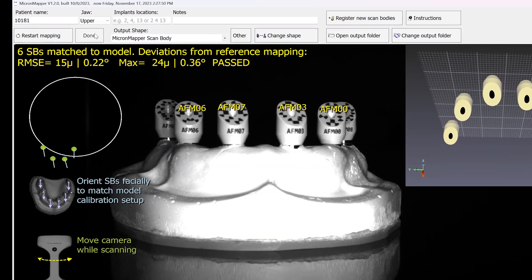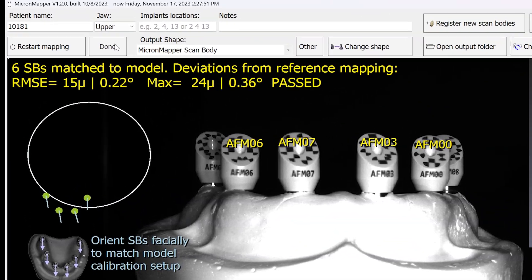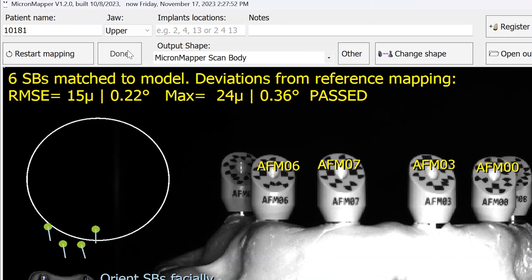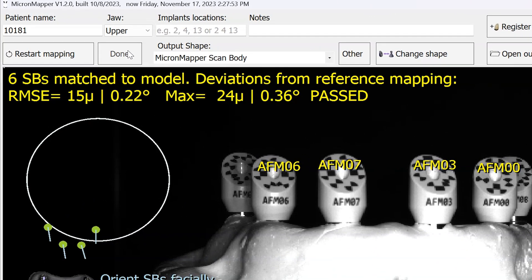After the scan is completed, if you look in the top left hand corner of the software, you'll notice that on average we got 15 microns of accuracy with a maximum deviation of 24 microns.